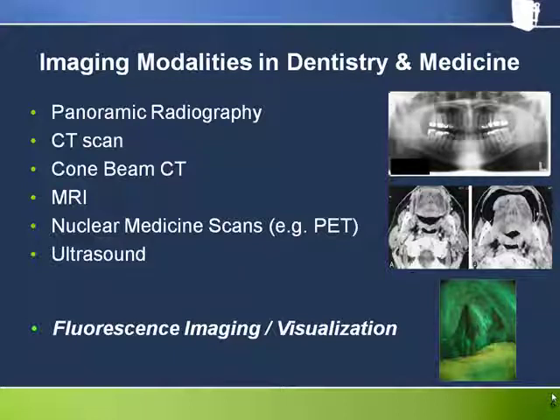These techniques are inevitably part of a larger picture that includes a lot of other information from other sources. Also, they are more useful in some contexts than in others. The value they bring often depends on the particular type of clinical situation in which they are used. Like these other methods, fluorescence visualization with VELscope adds value because it provides visual information that cannot be acquired in any other way. The fluorescence response of normal mucosal tissue to violet-blue excitation light, we'll see in later segments, is very sensitive to disease processes occurring within the tissue.